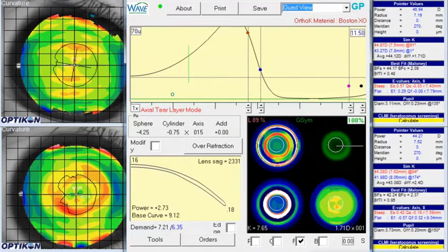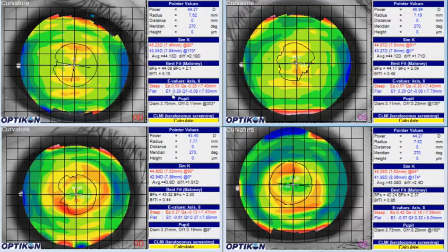this much clearance. Looking at the eccentricities, it's a little bit low in both eyes, and so that means this cornea is a little bit steeper. It kind of slopes down from the apex farther out into the periphery instead of flattening out. And if it is this cornea that slopes down more, then we do want a slightly taller lens, or a lens with increased sagittal depth. So either switching the patient to corneal scleral to really keep that lens very, very still, or increasing sagittal depth.